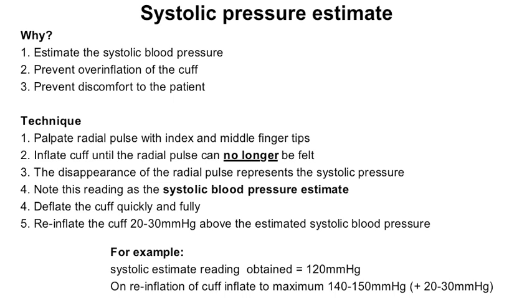It is important to accurately record the systolic pressure estimate, in order to estimate the systolic blood pressure, prevent over-inflation of the cuff, and prevent any discomfort to the patient. Locate and palpate the radial pulse using your index and middle fingertips. Inflate the cuff until the radial pulse can no longer be felt — the disappearance of the radial pulse represents the systolic pressure. Note this reading as the systolic blood pressure estimate. Deflate the cuff quickly and fully. Re-inflate the cuff 20–30 mmHg above the estimated systolic blood pressure. For example, if you obtained a systolic estimate reading of 120 mmHg, on re-inflation you would need to inflate the cuff to a maximum of 140–150 mmHg.